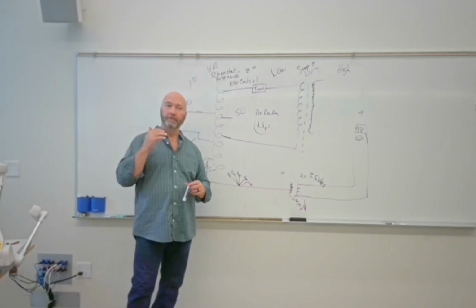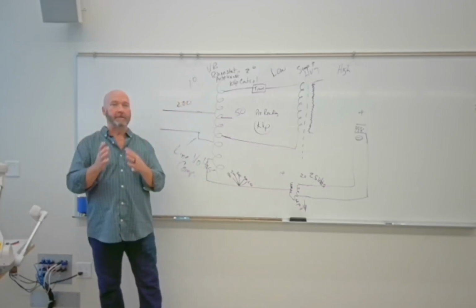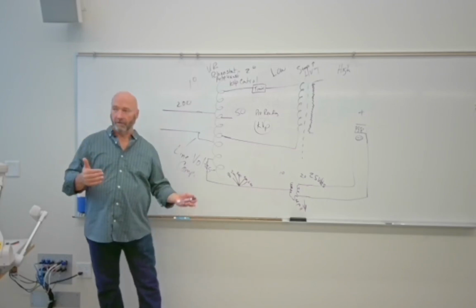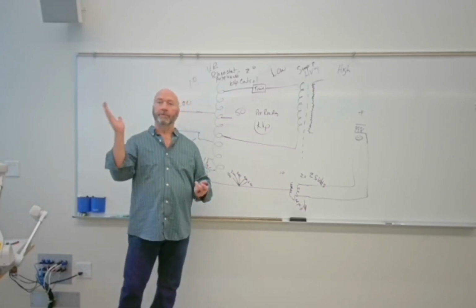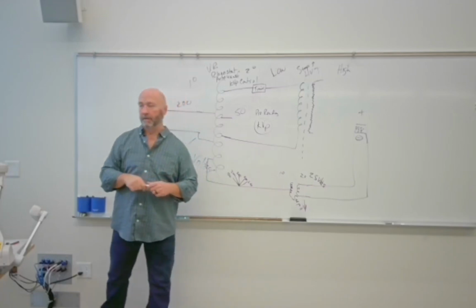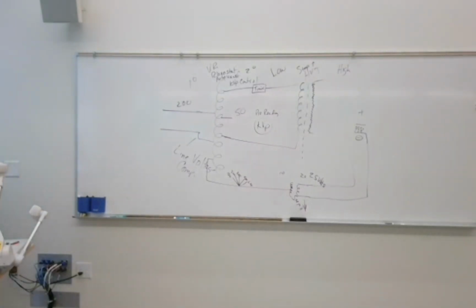So falling load generators are used to mitigate some of that, give you the highest possible mA to give you the lowest possible time. The problem is your machine can't maintain that mA throughout the entire exposure, so it falls. Your mA drops throughout the exposure. With long exposures, it's going to drop further and further. And that's falling load generator.